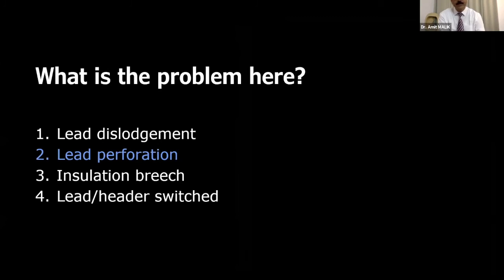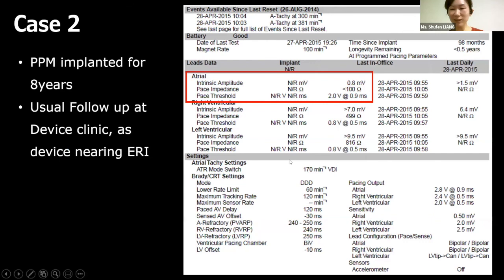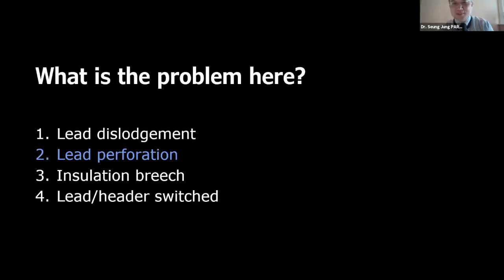So this is after how many days after the previous implant? 5 days post implant. So it actually perforated out into the lung. Yeah, that's why the patient had a cough when she went to the A&E. How old was the patient? 79. Female or male patient? Female.